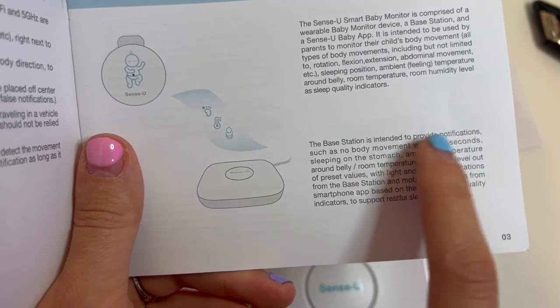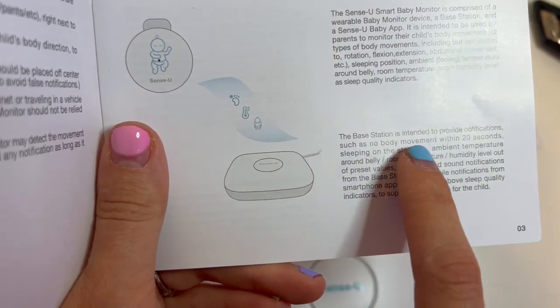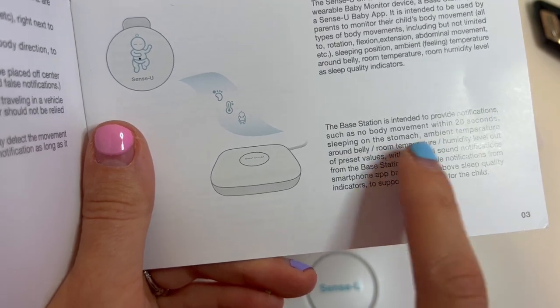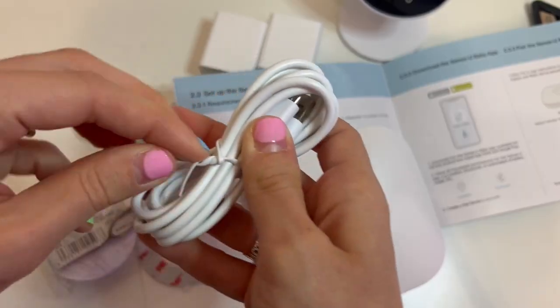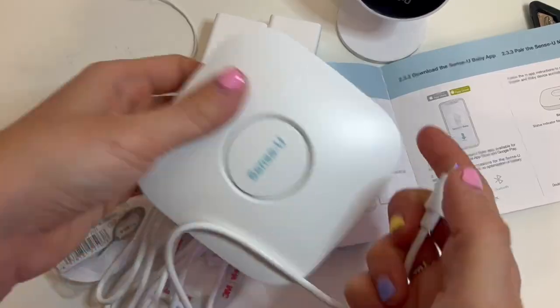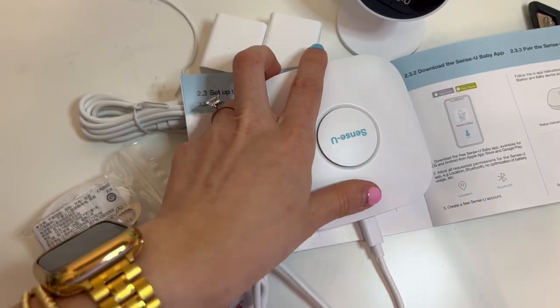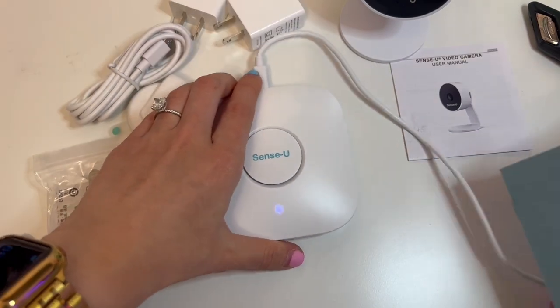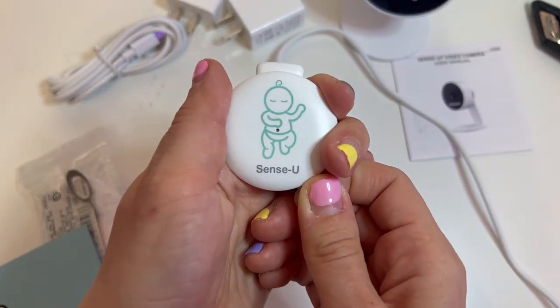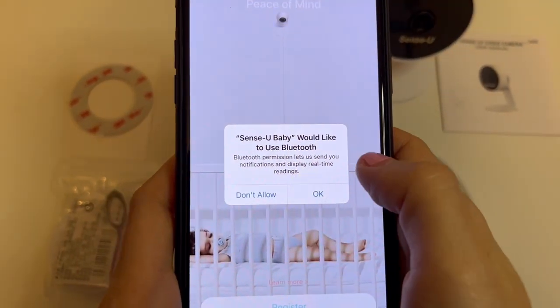I wanted to go ahead and check out what it said in the user manual. It's basically saying that this device is intended to provide you notifications such as no body movement for 20 seconds, the baby's on its stomach, temperature readings are off, and all that stuff that you set within the app. I then went ahead and opened the base station to get it started up. All these lights started flashing, and then I took out the little clip so the battery could be connected to fully finish setting up the baby monitor.